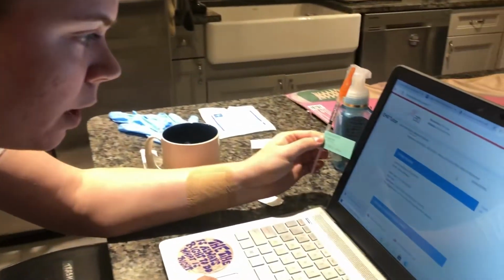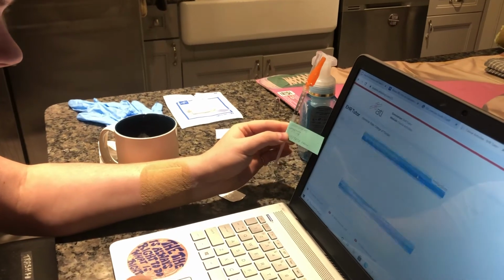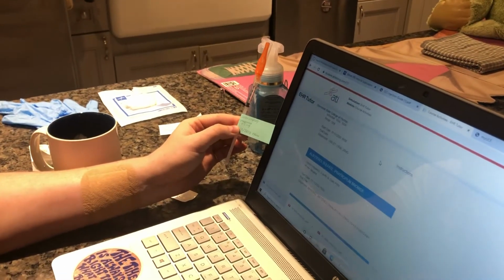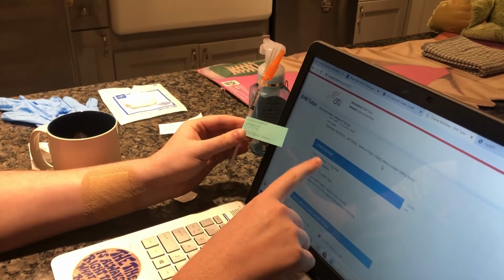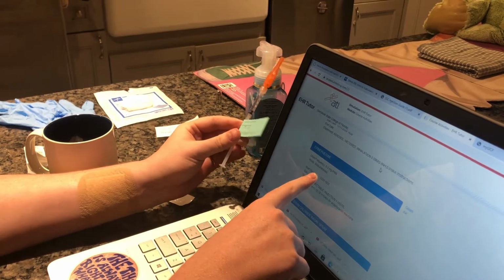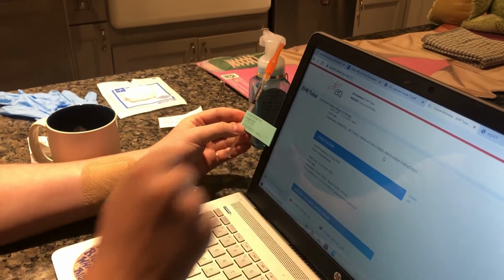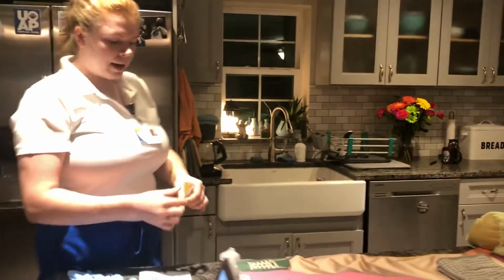And then I'm going to take this and I'm going to compare it to my chart. So I have Oscar Simpson. We're going to do epinephrine. If I can find it. Epinephrine, the dose is 0.5. We're giving it subcutaneously. And then the time we're giving it is now. Okay, so that looks good to go. I'm gonna go ahead and gather all of my equipment needed.